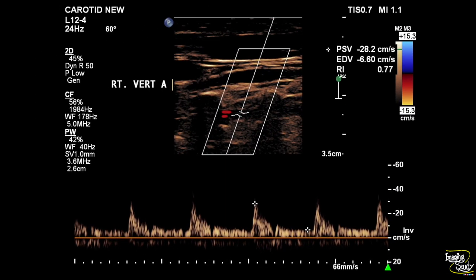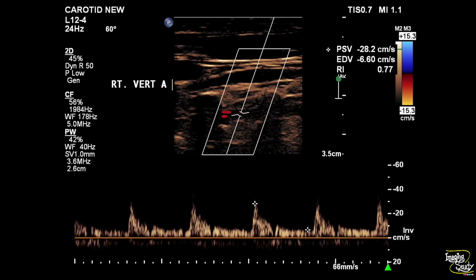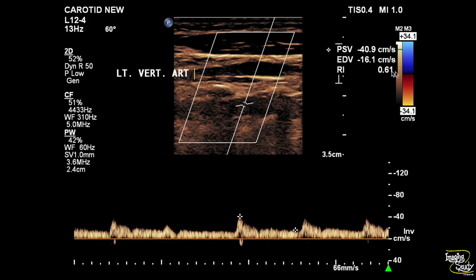Now let's end with the vertebral arteries. Both vertebral arteries show normal flow velocity. The right vertebral artery shows around 28 centimeters per second and the left vertebral artery shows 40 centimeters per second. The resistive index is higher on the right one, so the left vertebral artery is relatively giving the brain more blood supply. However, both are showing antegrade flow.